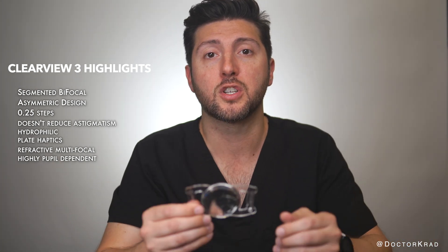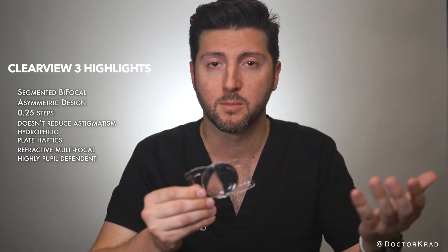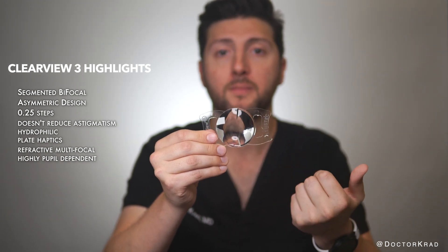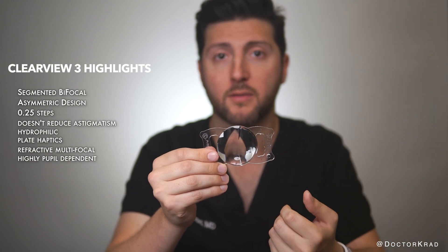In what orientation should a surgeon implant the lens? Of course, the lens should be centered on the visual axis — that's most important. But both the distance and the near segment need to be close to the pupil. If not, the vision for the segment not near the pupil will suffer.